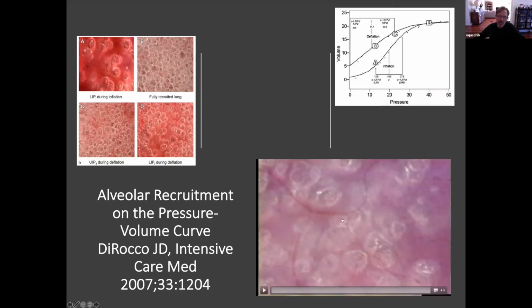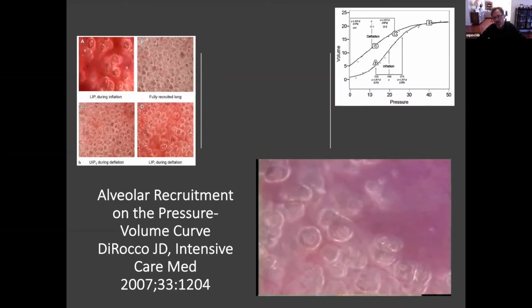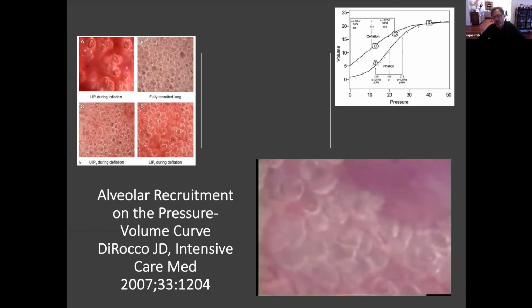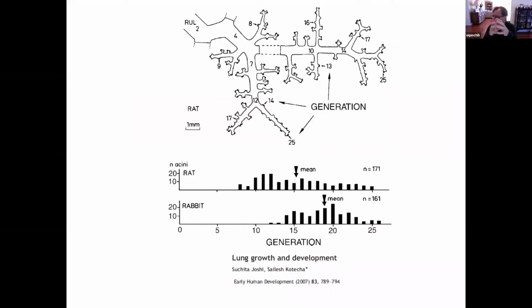However, as soon as the lung starts to collapse in disease, as we can see here in this lung video, we have alveoli on the surface that you can see. They're not changing in volume while we're now increasing the pressure with the pressure volume curve. And as you may see here, you get these popping up of alveolar space, and that's the unhealthy part around lung recruitment or tidal breathing in a sick lung. So we have to differentiate. In healthy lungs, we don't have ventilation happening or bulk flow happening inside the alveolar space.